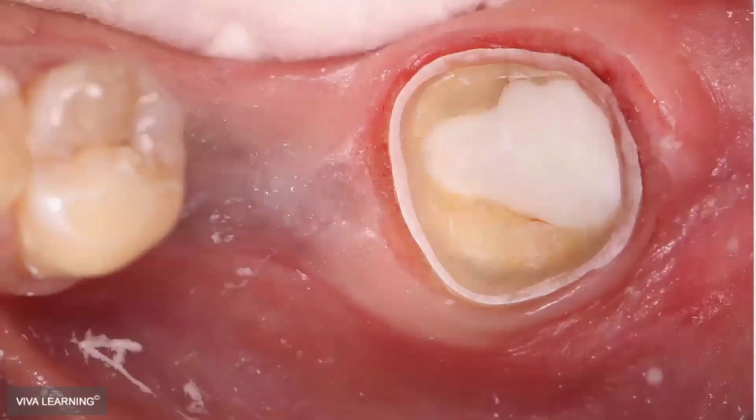Now, a milder version of that is just using this for some of your traditional or digital impressions. Kudos to Dr. Tim Anderson up in North Dakota for borrowing this image from him. Look how smooth this cut is all the way around there. And there's times where I will, to the point of what we were just talking about, not hit the tooth.